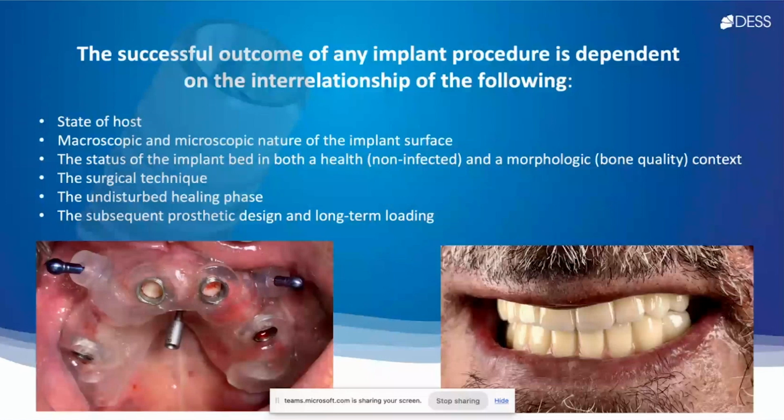And by the way, this dental implant, as you know, totally matches Straumann in the size of the implant and the kits and so on. So I usually use the Straumann guided kit for placement of this dental implant.